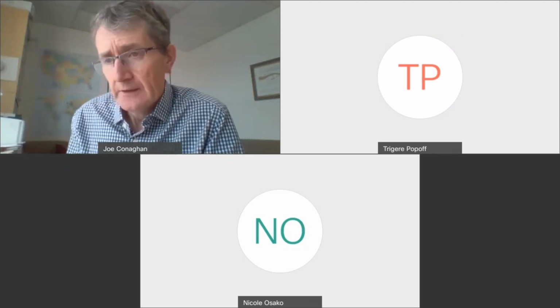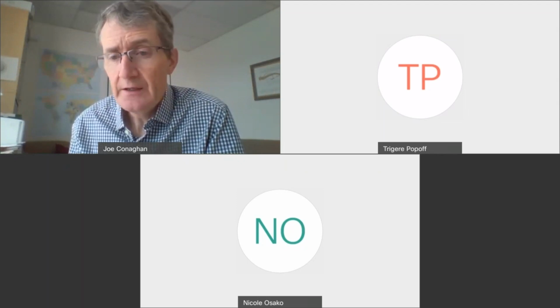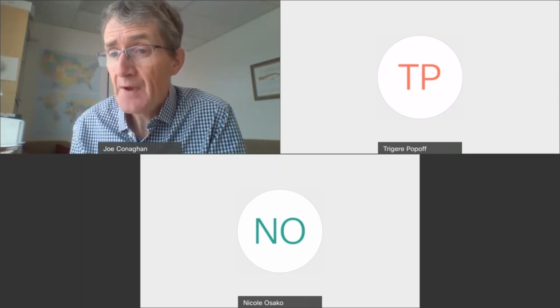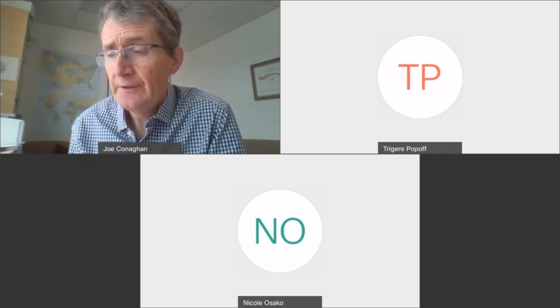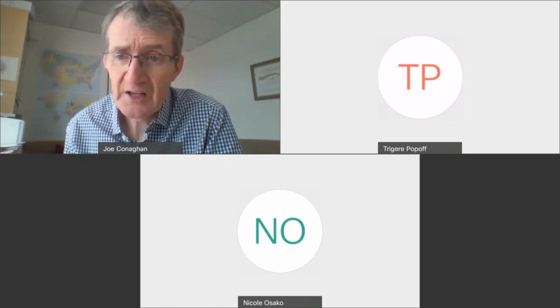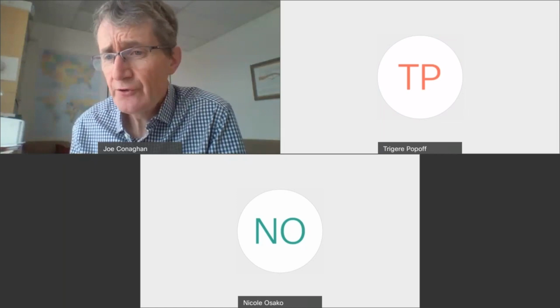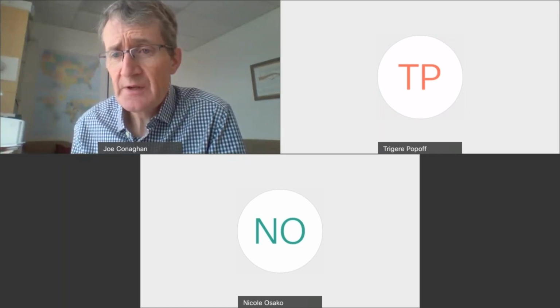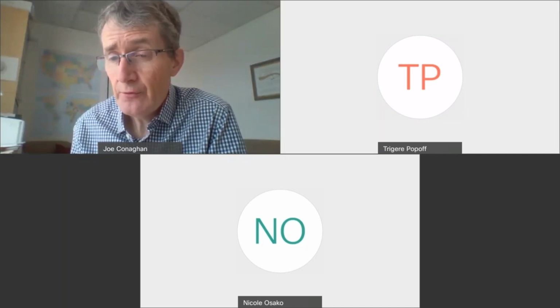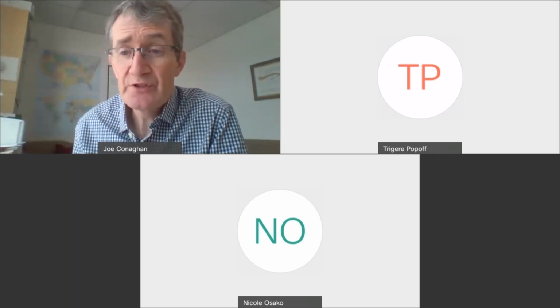Well, there are many protocols out there. I've seen a lot of protocols where they say 90 seconds is the maximum time in the vitrification solution. And probably a lot of you will go slightly more than a minute, maybe as long as 90 seconds. The reason there's a time limit in the first place is because we're using cryoprotectants like DMSO in these solutions, and the amount of cryoprotectant in the vitrification solution is 30% by volume.